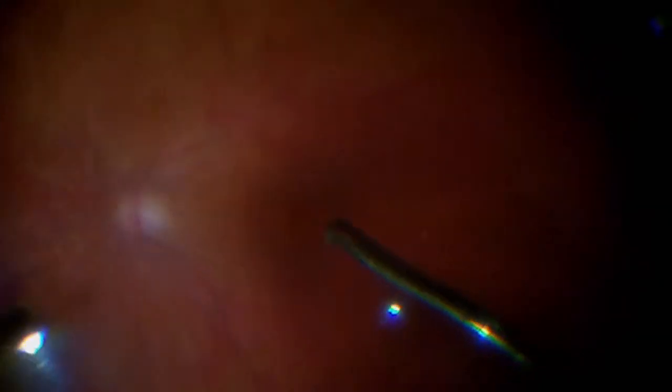We then exchange the saline solution we're using in our infusion to an air bubble that will allow us to drain all of the fluid from the eye, including the fluid that's trapped underneath the retina.